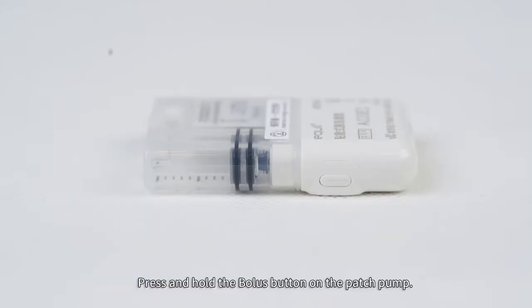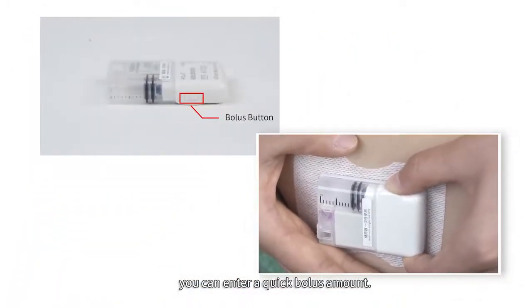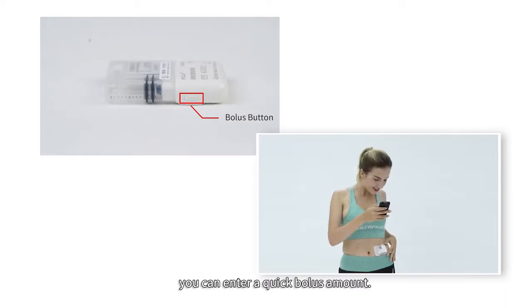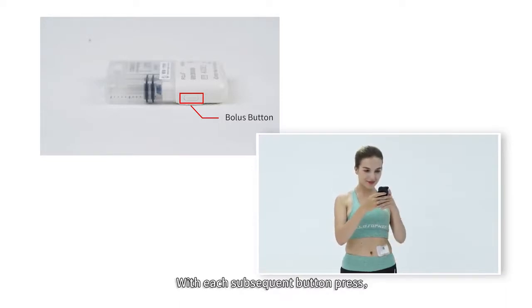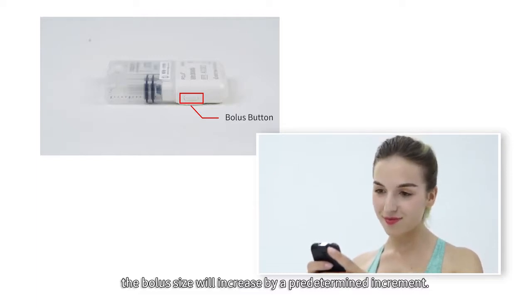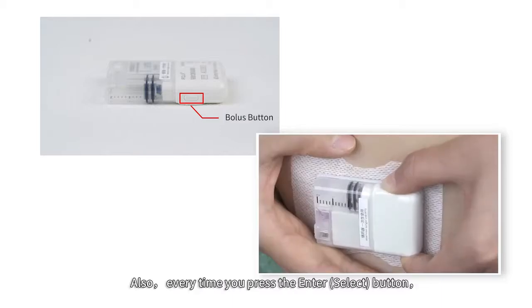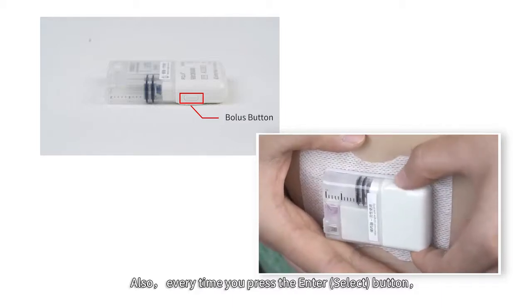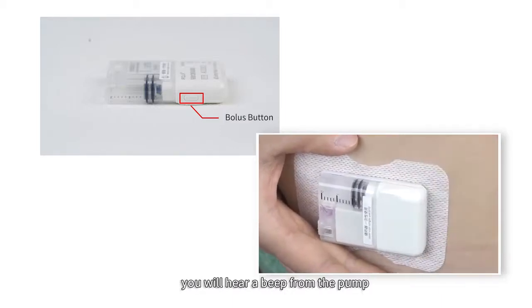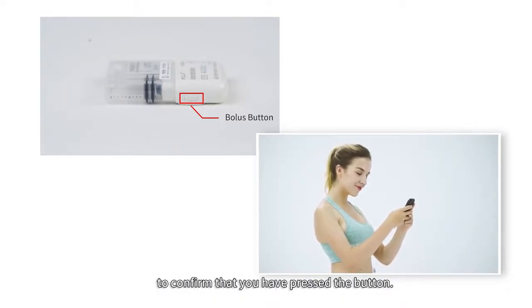4. Quick boluses. Press and hold the Bolus button on the patch pump. The pump will give an audible alert which indicates that you can enter a quick bolus amount. With each subsequent button press, the bolus size will increase by a predetermined increment. This increment can be set in the Settings menu. Also, every time you press the Enter Select button, you will hear a beep from the pump to confirm that you have pressed the button.